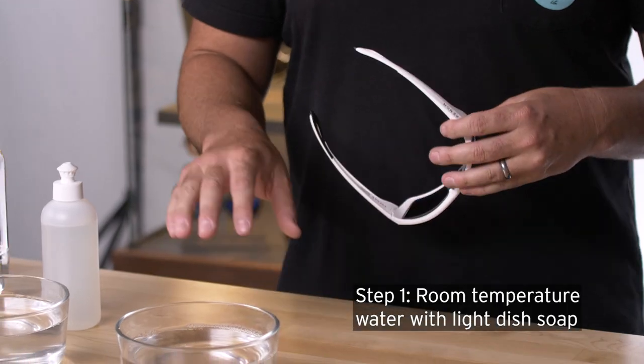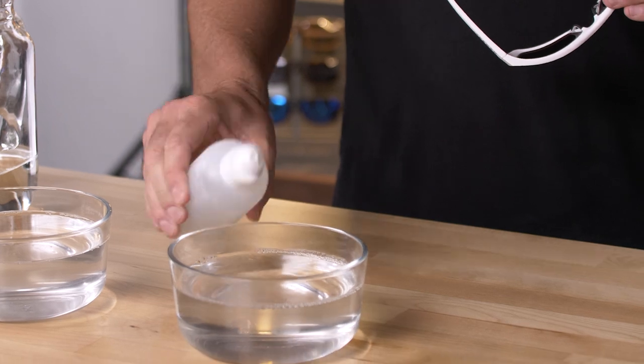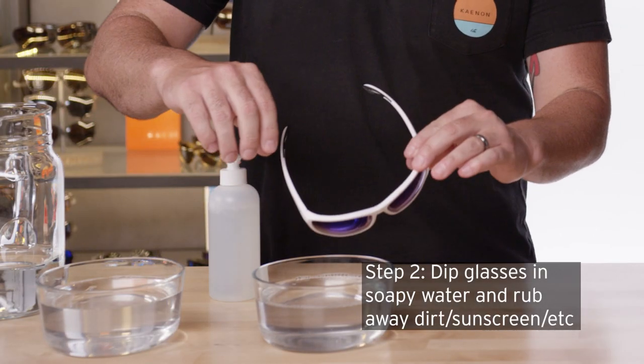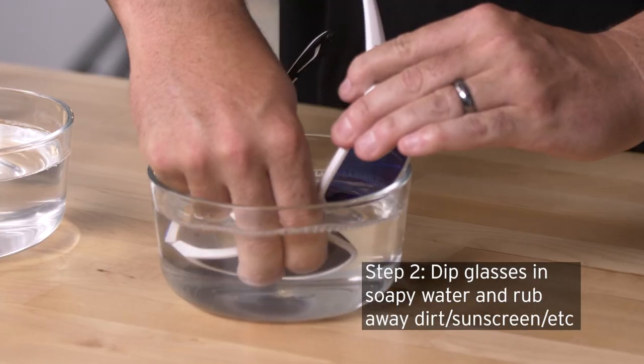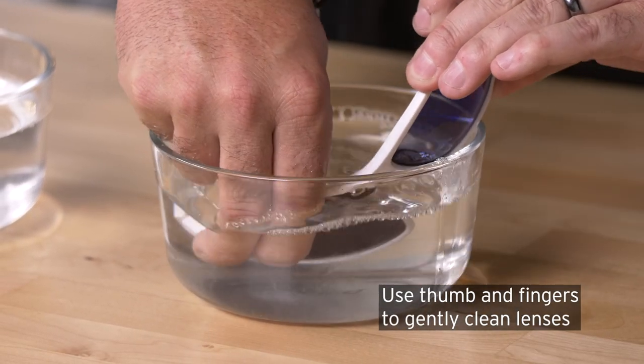I'm always tempted to clean them with my shirt. How should I clean them properly? What you want to do is get some room-temperature water, get some light dish soap, add a little in there. Get your glasses and just dip them into the soapy water. Use your thumb and your fingers just to get all that salt and sunscreen off.